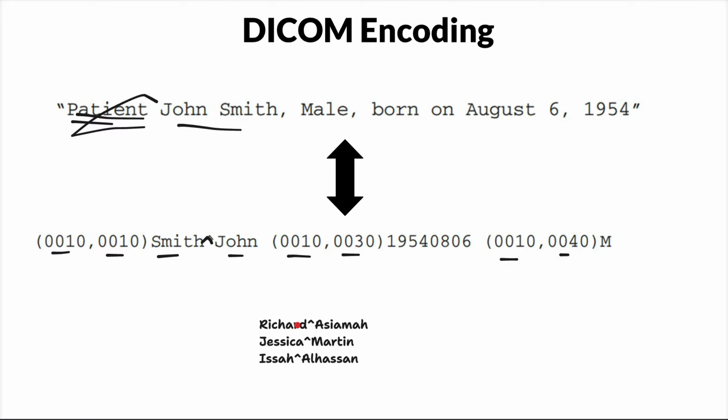Then here, if you want to give it, then you can go ahead to say, okay, I'm giving the tag with 0010, 0010. That defines that. Then you can go on and define the rest, 0010, comma, then whatever you want to put over there.